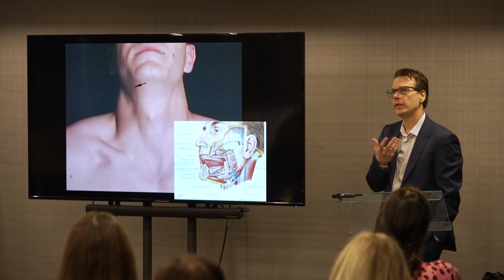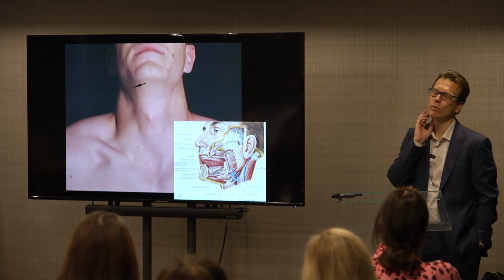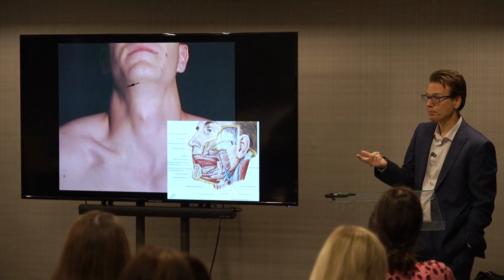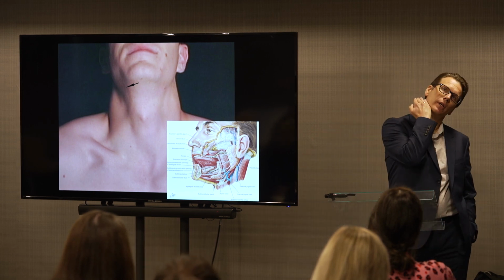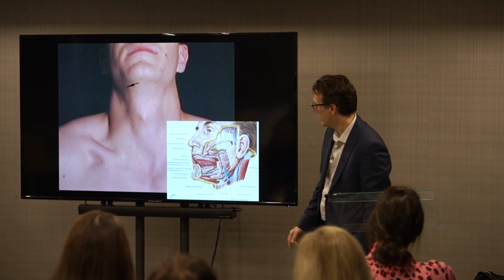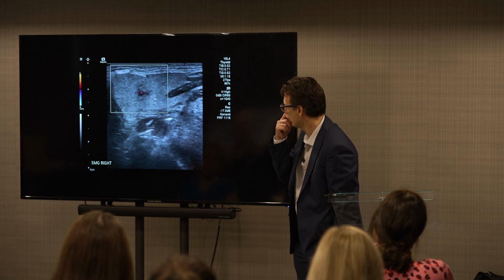So once I've finished interrogating thyroid, I return to the superior part of the neck, and I'm going to look at the level 1B region, so looking at submandibular gland, submandibular duct, level 1B lymph nodes, and essentially put the probe on and just scan from mandible down. So what does that look like on ultrasound? Next one, please.